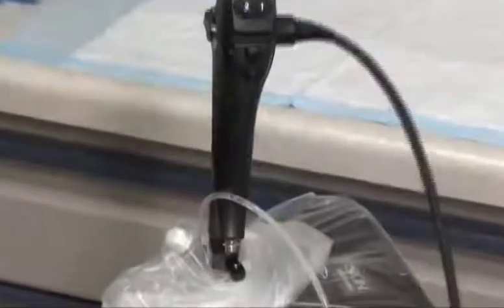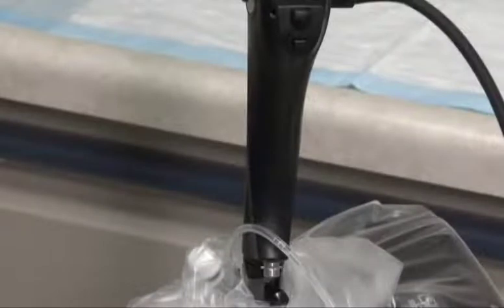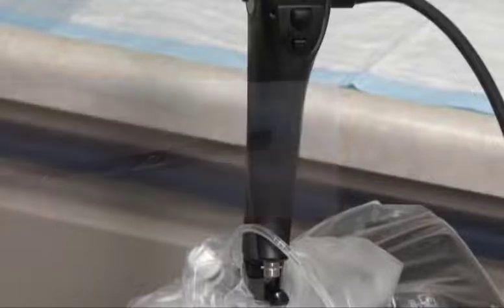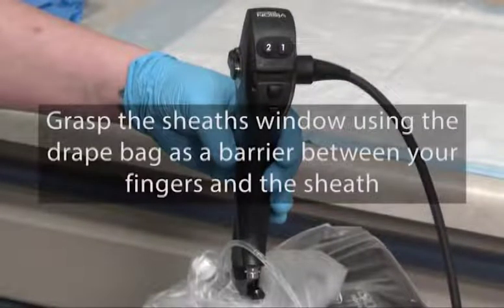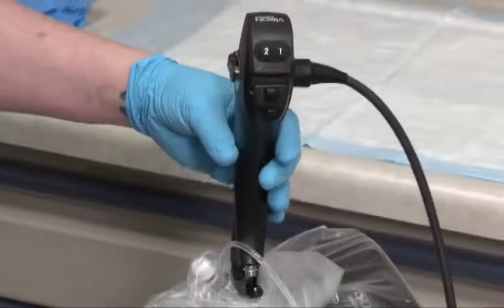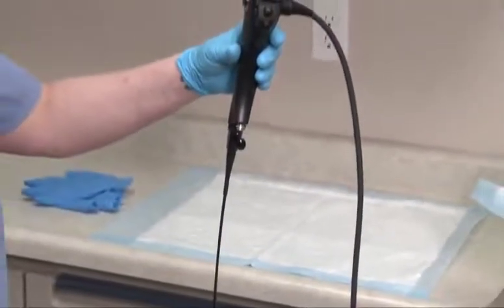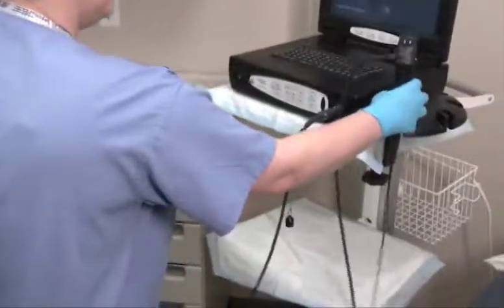Rotate the locking knob into the vertical position so that it is aligned with the slot on the endosheath connector. Using the angulation lever, articulate the distal bending section of the endoscope into the straight or neutral position. Hold the endoscope's control body in one hand. Using the bottom outside portion of the drape bag as a barrier between your fingers and the sheath, gently and carefully grasp the sheath's window, then slowly and gently withdraw the scope from the sheath. Do not twist the endoscope when removing it from the sheath, as doing so can damage the insertion tube. If you experience difficulty removing the endoscope from the sheath, do not use excessive force. Place the endoscope in a non-contaminated area.